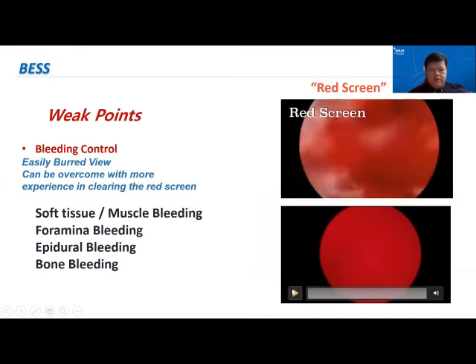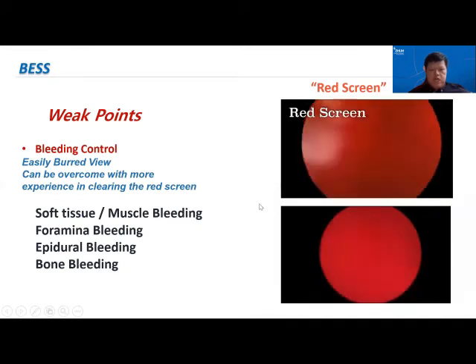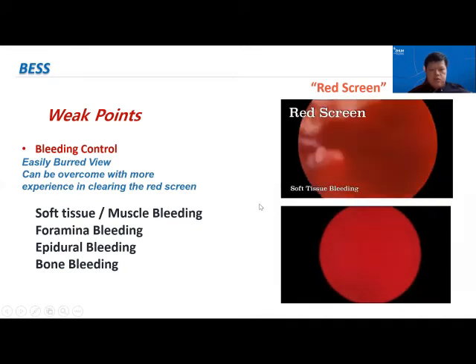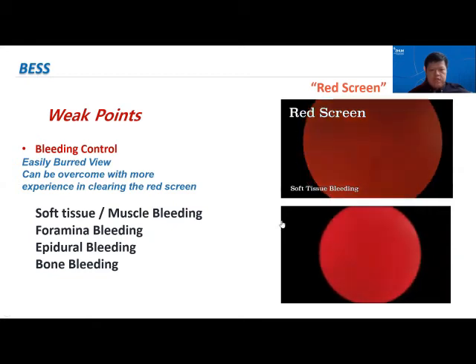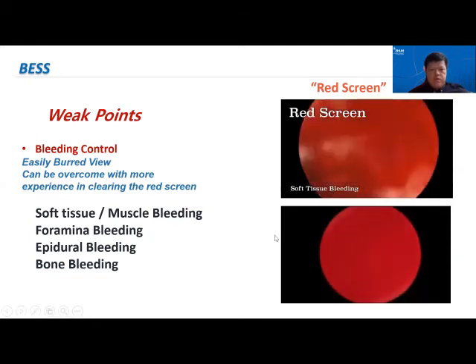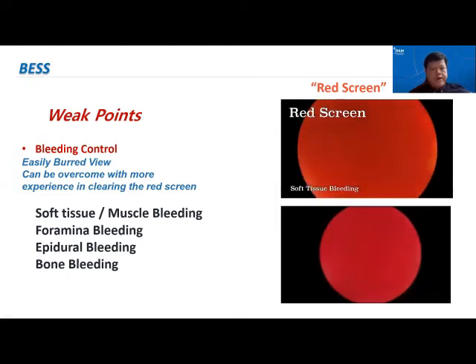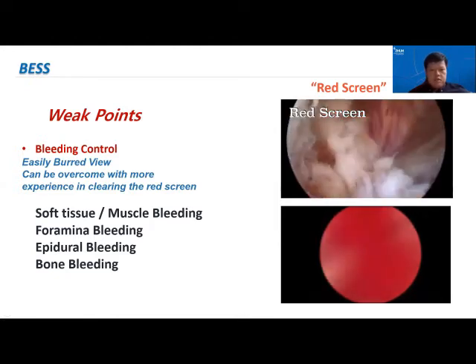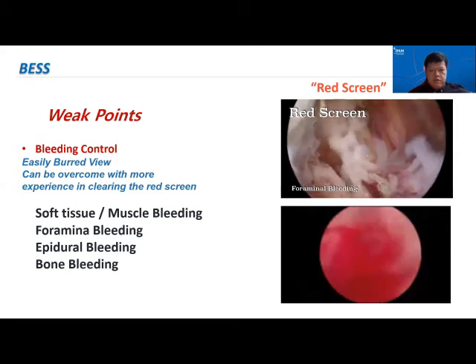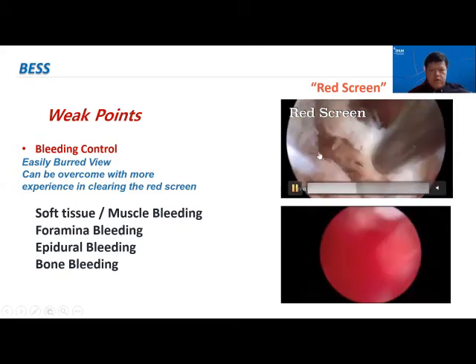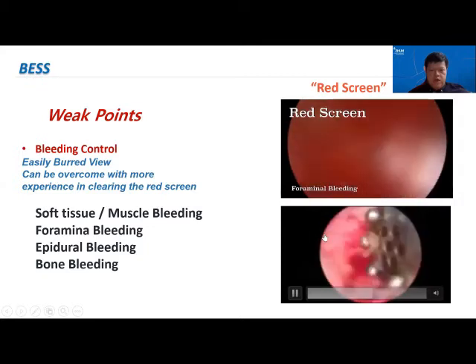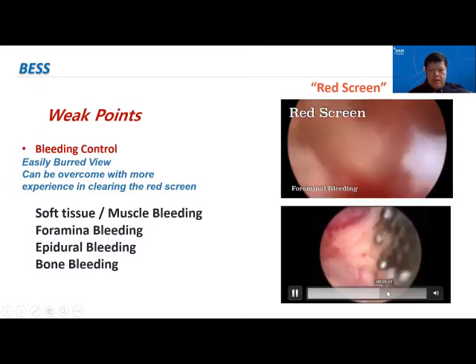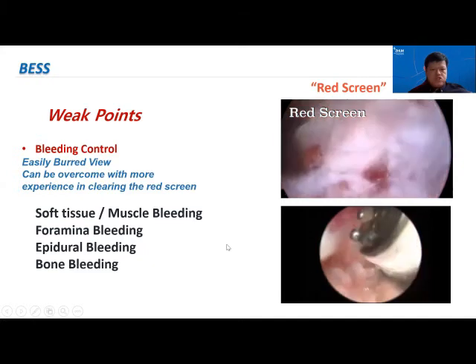However, because of the separation between the visualizing endoscope port and the working instrument port, if there is bleeding it tends to be a little more difficult to control. However, with good hemostasis techniques and experience, once it gets under control, the visualization improves and you can work better with the instruments.